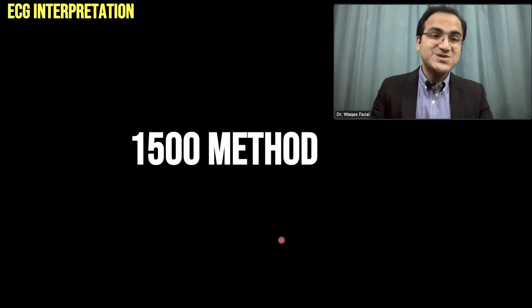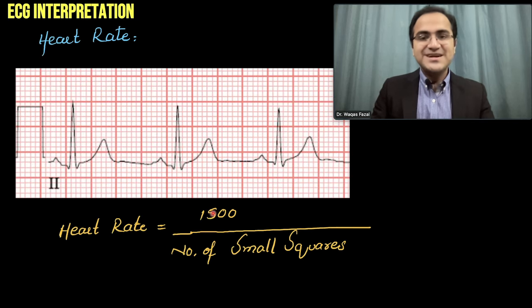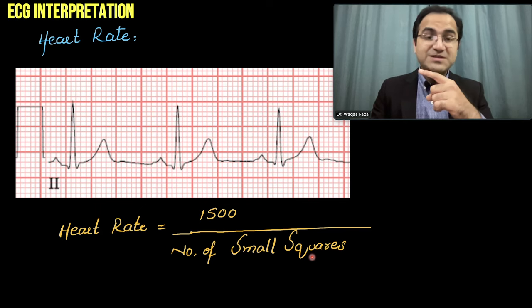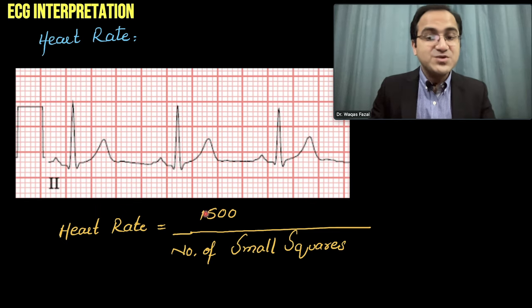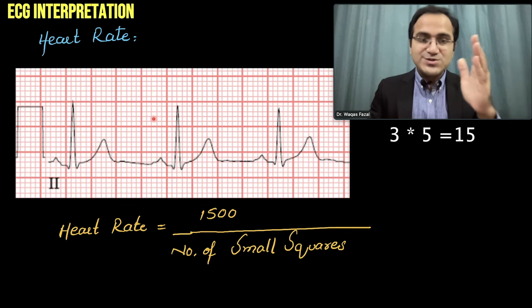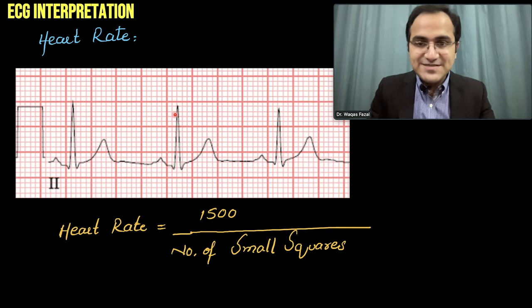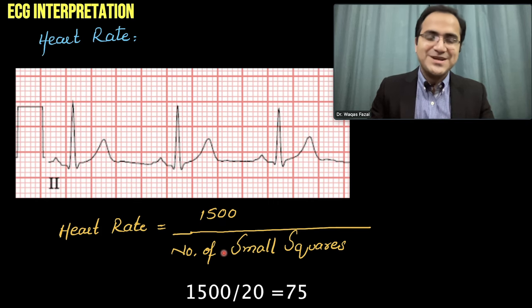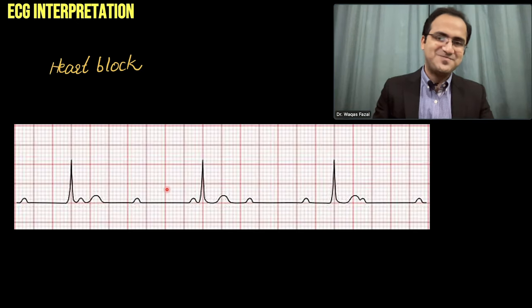The third method is the 1500 method. Instead of dividing 300 by large boxes, you divide 1500 by the number of small squares between QRS complexes. Counting the small squares: three large boxes × 5 small boxes each = 15, plus 16, 17, 18, 19, 20 small squares total. 1500 ÷ 20 = 75 beats per minute — the same ECG calculated three ways.